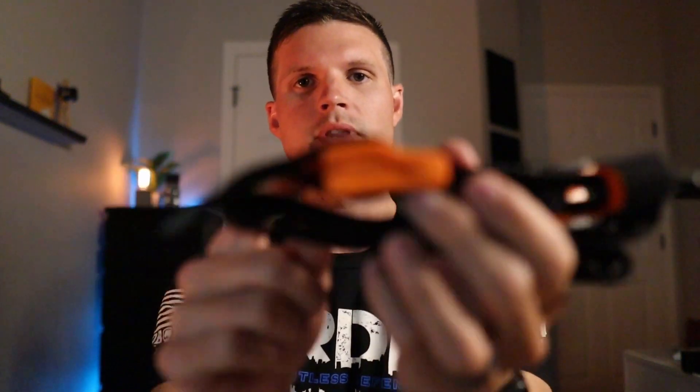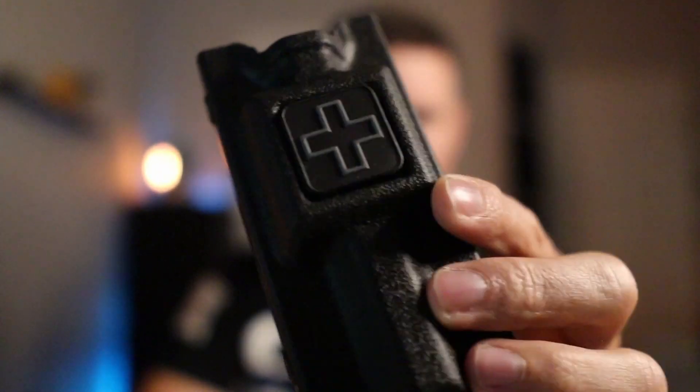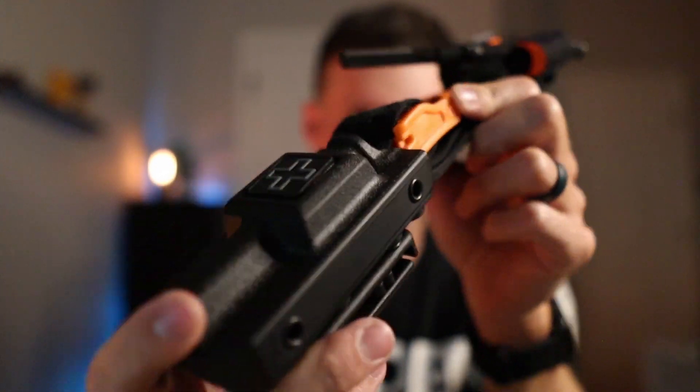One downfall of this tourniquet is that I don't believe it's going to fit in a standard tourniquet holder — this is the typical duty-carry holster for your tourniquet. The problem is that big plastic piece on the end: there's no way this is going to fit.